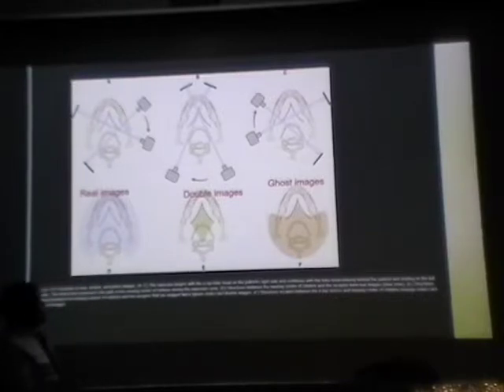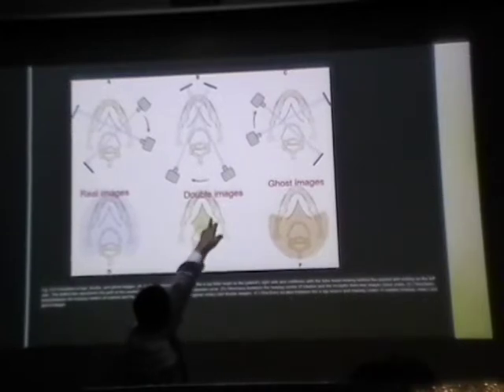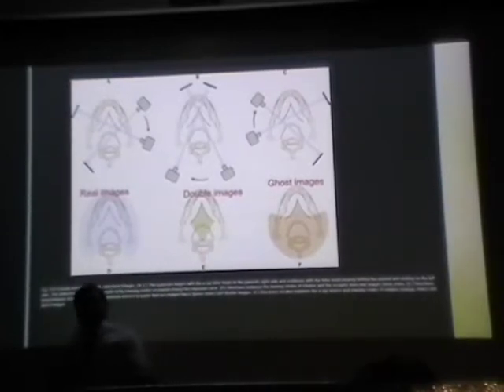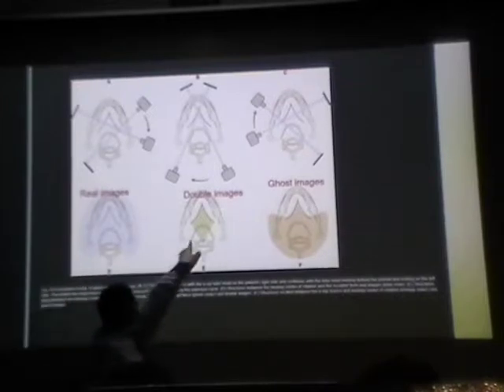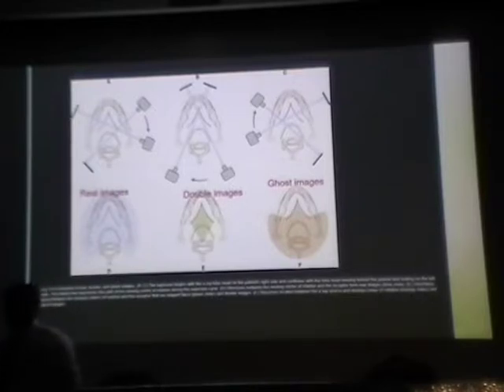Okay? Like for example, the structures that are falling in this region, that's where you are going to see double images. So for example, this is the hyoid bone, right? You're going to see two hyoid bones, because we don't have two hyoid bones, but there's one, because it is capturing twice, you're going to see as a double image.